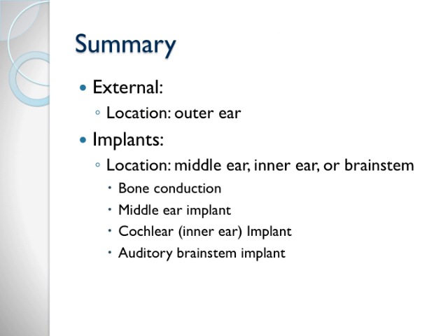So to summarize the technologies we've talked about, we've come quite a long way since ear trumpets and bulky tabletop solutions. Tiny digital outer ear hearing aids now function seamlessly with our lives for many cases of hearing loss where all that is needed is some amplification. When more than just amplification to the eardrum is needed, we look at a variety of implant procedures which bypass dysfunctional parts of the ear. The processors of all the implant solutions sit just outside the temporal bone, which means upgrades can be easily done as technology evolves, and routine surgeries are not needed.